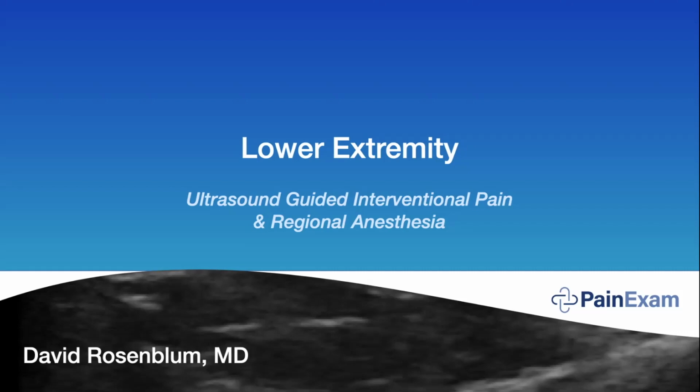For the nerve blocks for cervical dystonia, other than Botox or trigger point injections of local, I would probably recommend cervical medial branch nerves, which we will get into later. It's usually just cervical medial branch, I'd say.